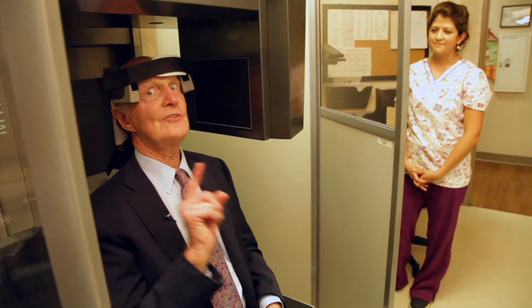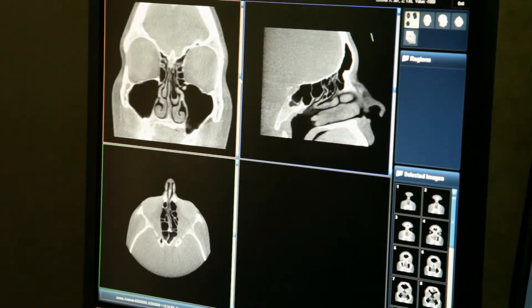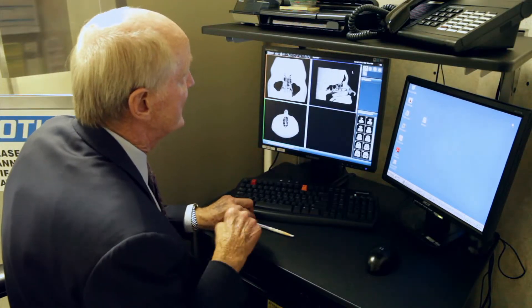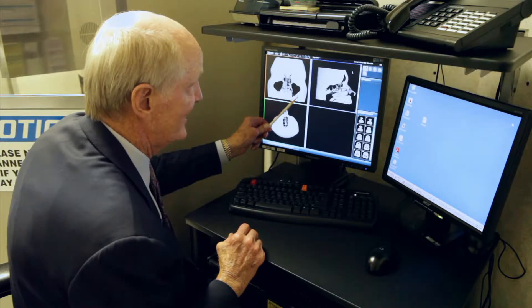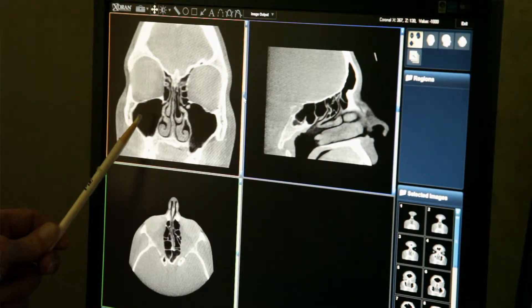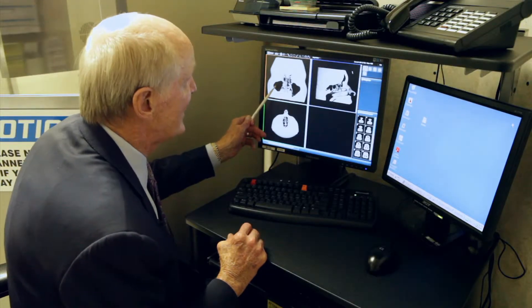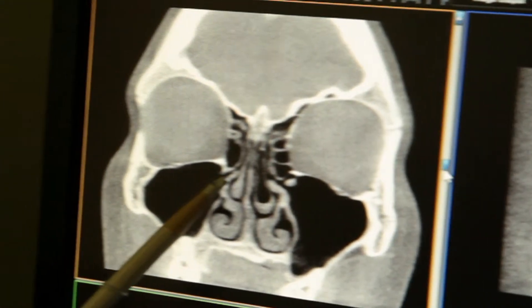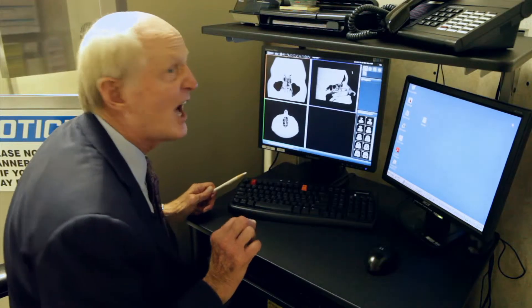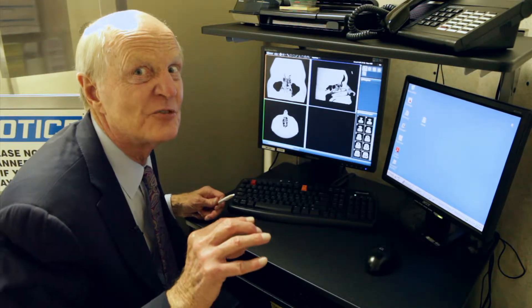Wait a second — let's go look and see what it looks like. So here we are. This is what a CT scan of the sinus looks like. The patient is looking at me, so this is the left side and this is the right side. When we see blackness, that's great — there's air in there, and on this sinus it looks great. What we have to do is follow this little area right here, called the osteomeatal unit, and that's where all of the sinuses drain.